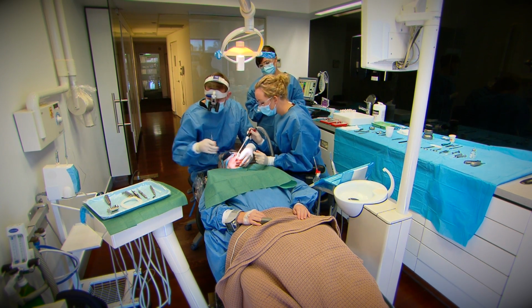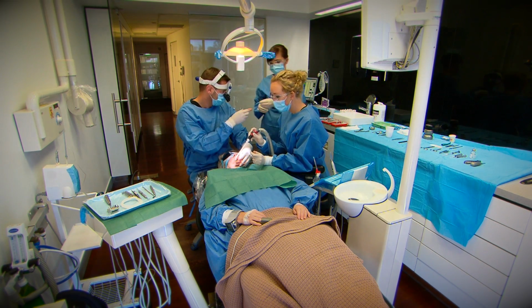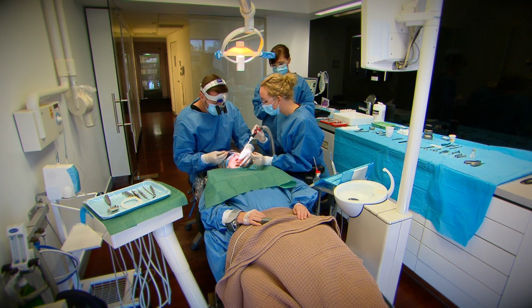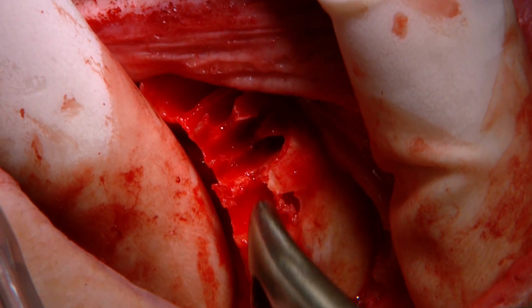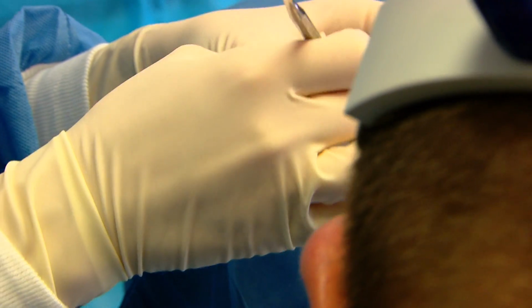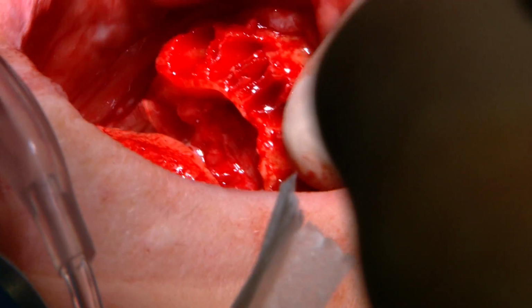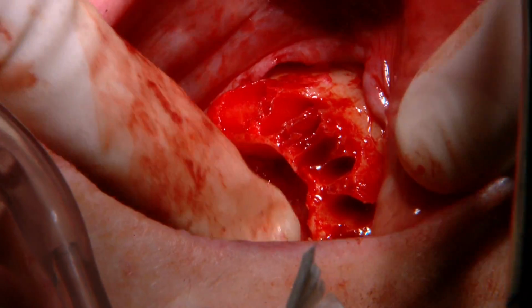It removes a lot of the bacteria and the infection, and allows us to use the bedrock, or the harder bone, underneath. The other advantage of this is it means that our bridge will be taller. And the reason the bridge being tall is a good idea is it means it's stronger. The more bulk of material makes it a stronger bridge, which means that it's less likely to fracture down the track. This bone here is kept as well, and we use that.